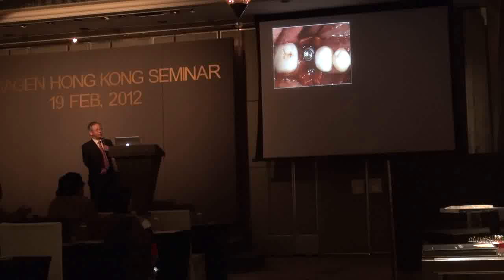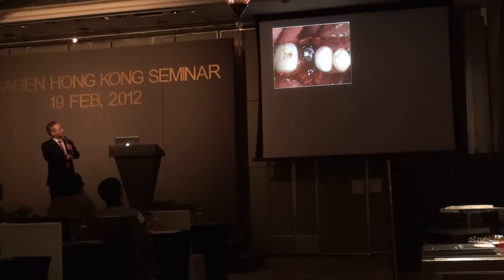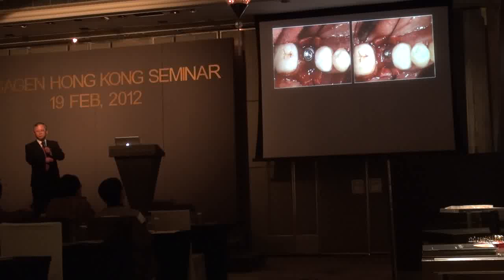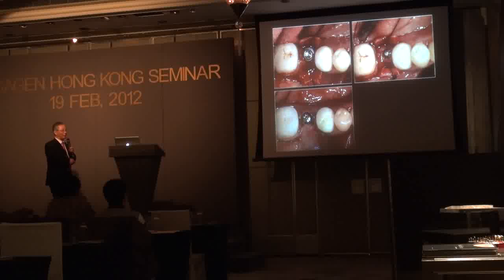So look at this case. This is the first molar, mandibular first molar case. I placed a 5 mm diameter implant, but with the resorption of the ridge, almost all around the implants we have bone defects, right? We're going to have bone defects. But after placement, this much. This is not good enough. So we have only 1 mm of bone here. But compared with this, it is much more predictable. And I didn't put any bone graft and connected healing abutments in one-stage surgery.